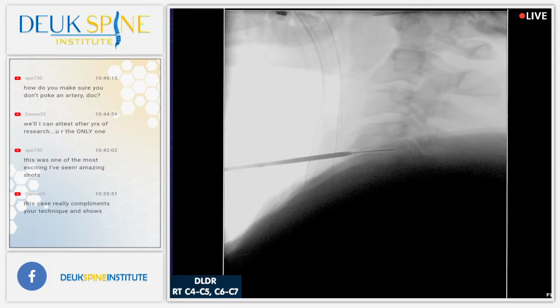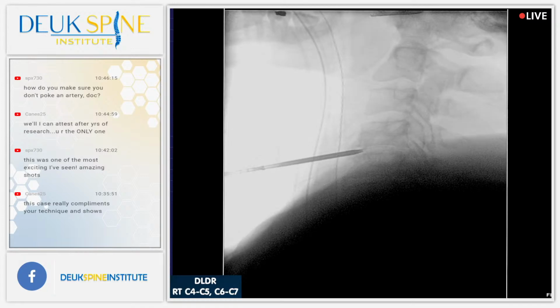Ready? Good. Yeah. You want a little shoulder? Yes. Shoulder pull? Little shoulder. Shot. We're going to do a little distraction. That's me right there. Yes, sir.